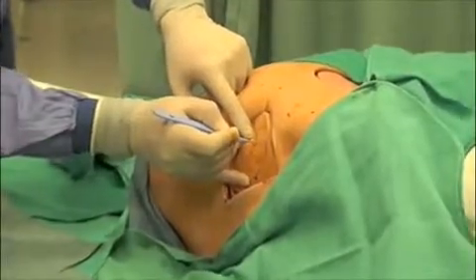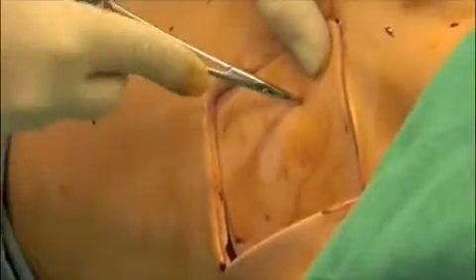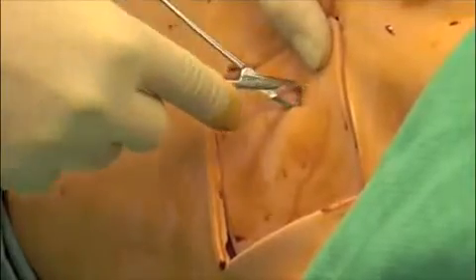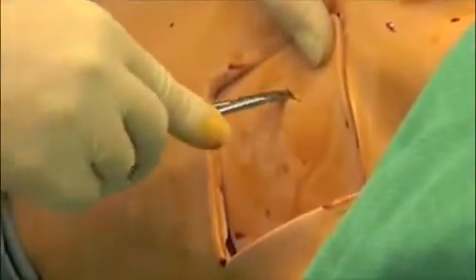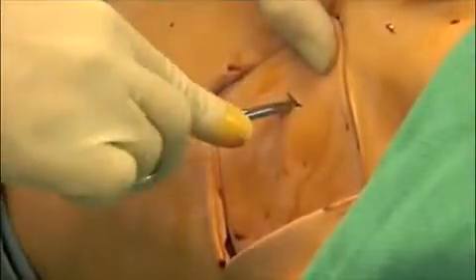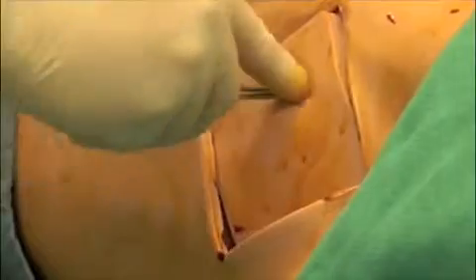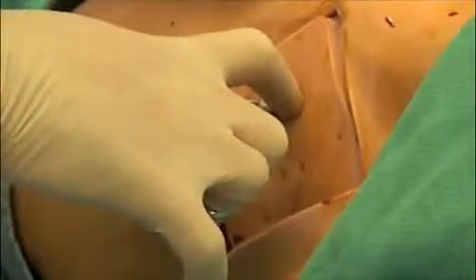Using a scalpel, make a 2 to 4 centimeter incision following the orientation of the ribs. Using curved forceps, bluntly dissect through the subcutaneous tissue just over the superior border of the rib. Puncture the parietal pleura with the tip of the forceps. This should release a rush of air or fluid.